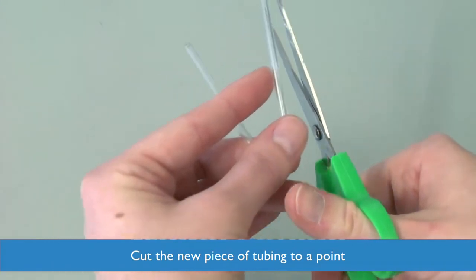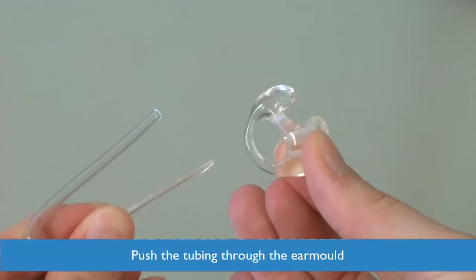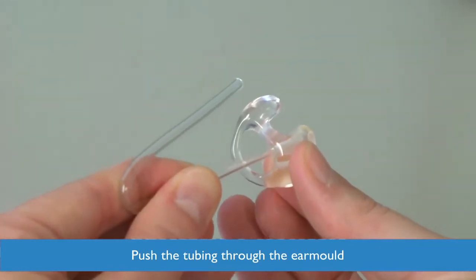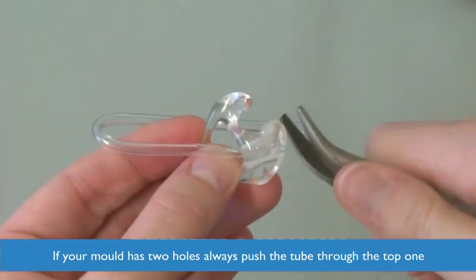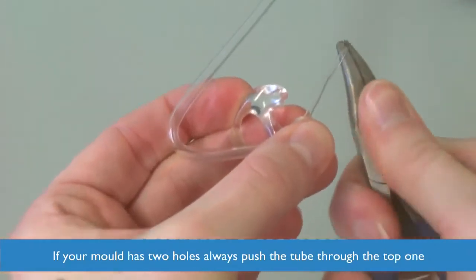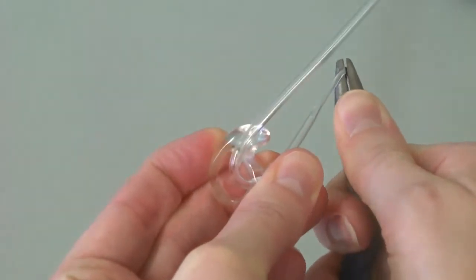Cut the new piece of tubing to a point. From the outside of the ear mold, push the tubing through until it comes out the other side. If your ear mold has 2 holes, then always push the tube through the top hole. The other one will be a vent.